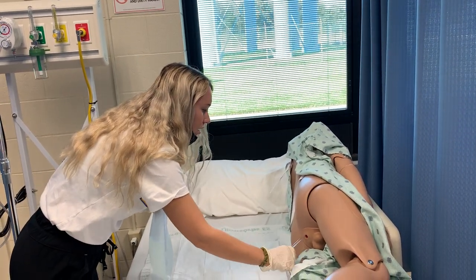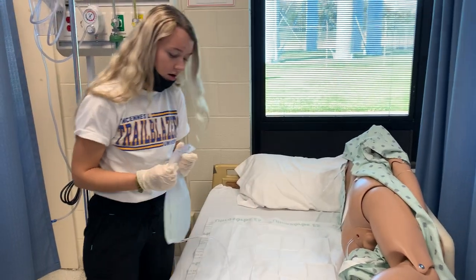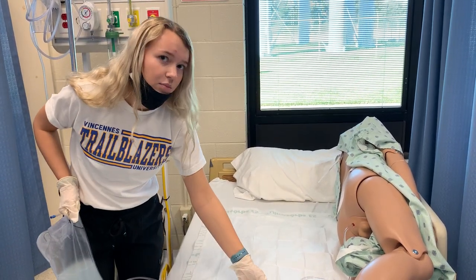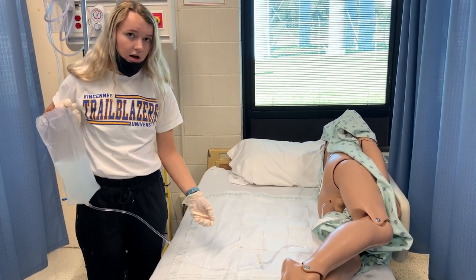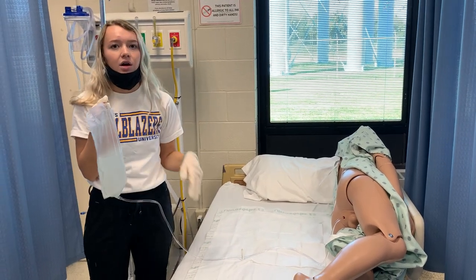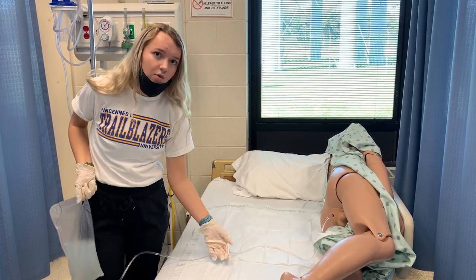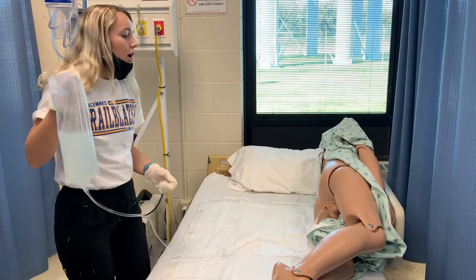We're going to insert it three to four inches into the rectum. It's 1,000 mL for a soapsuds enema, and it's 105 to 110 degrees. Once that's in there three to four inches, we're going to start it at the hip and unclamp it. As the patient tolerates it, we're going to raise it up. If they have any cramping or start complaining, we can lower it back down by the hip, clamp it off, and once they're ready, unclamp it and start raising it back up again.